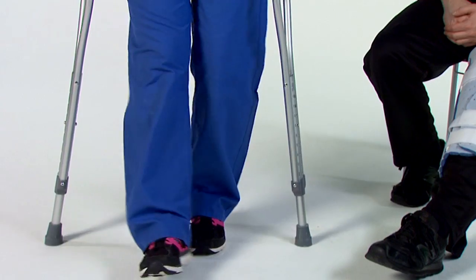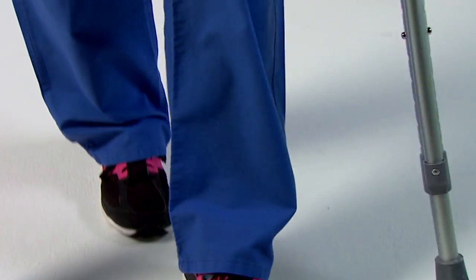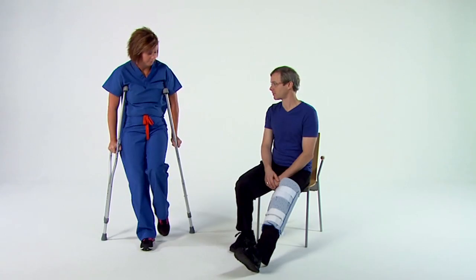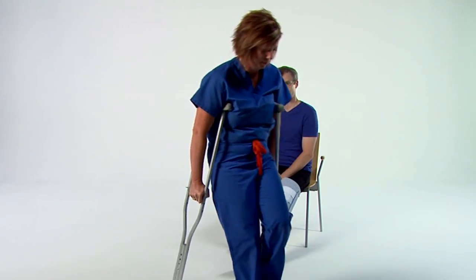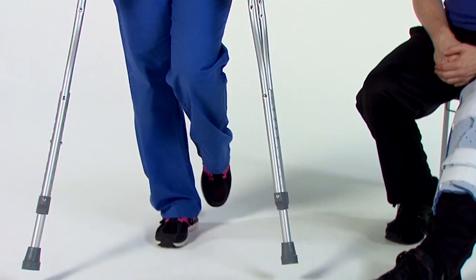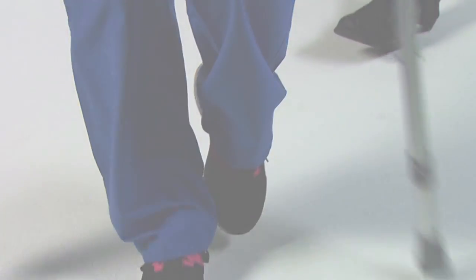It's very important to follow your instructions to prevent a fall or other serious injury. If you're non-weight-bearing, it will be because of a lower extremity block or a surgical repair. Bearing weight at any time may result in a fall. Don't put any weight on your surgical leg until your doctor tells you it's okay. If you're non-weight-bearing, your team will determine the appropriate position for your surgical leg.